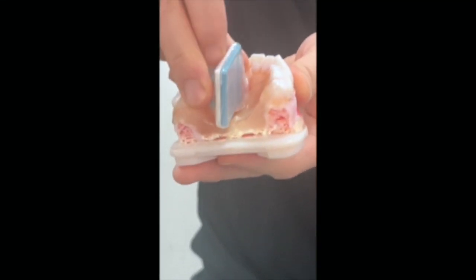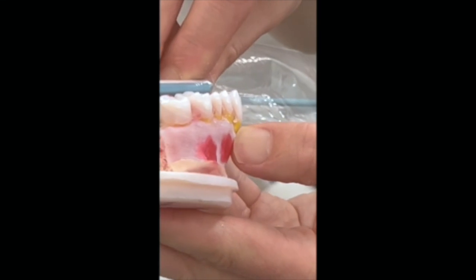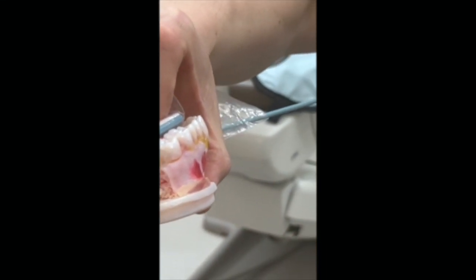You want to make sure to follow the angle, as you can see. Then you can see the palatal root and then make it a more acute angle. Then bring the X-ray tube, as we can see in the video.